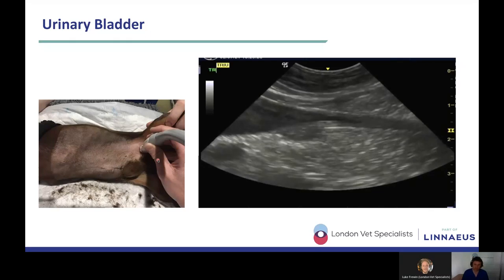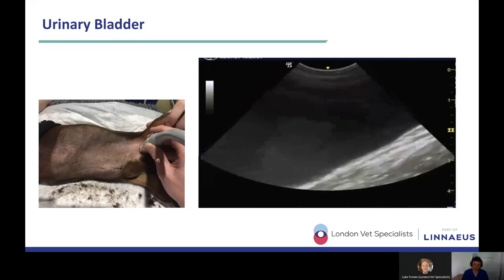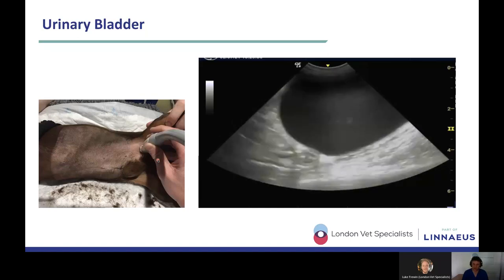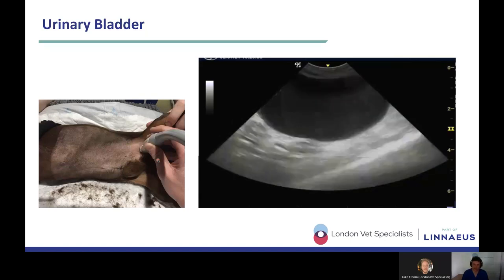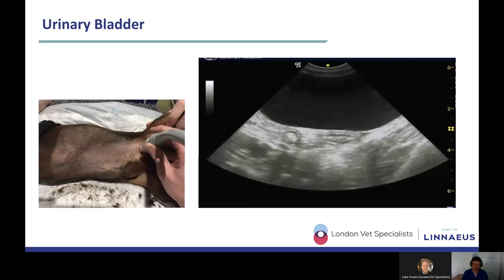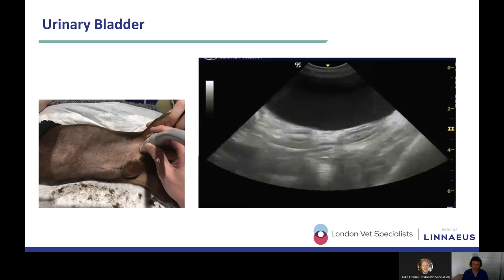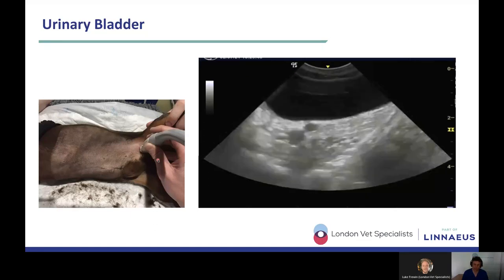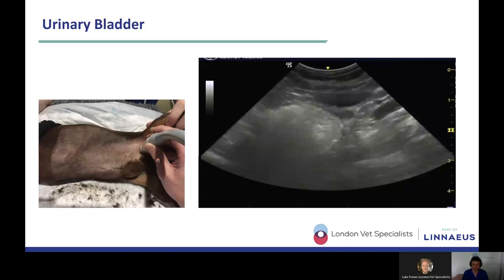So the viscus is filled with fluid. And the important thing, again, is that you do a comprehensive assessment of the urinary bladder. That consists of sliding from cranial to caudal initially, fanning slightly as you go, and then rotating the probe 90 degrees, so you've got a short axis view of the urinary bladder, and again, sliding cranially and caudally.